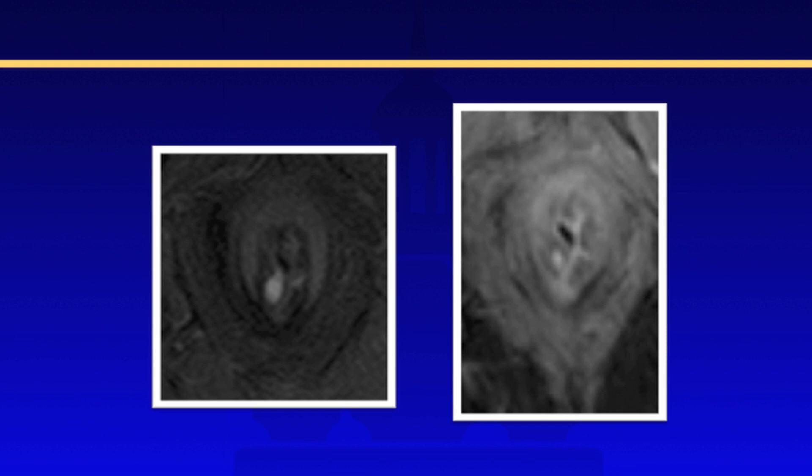Dedicated axial T2-weighted image on the left and axial post-contrast image on the right demonstrates a small intersphincteric fistula at 7 o'clock. Please note that the fistula is between the internal and external sphincters and is nicely shown here in a diagram.